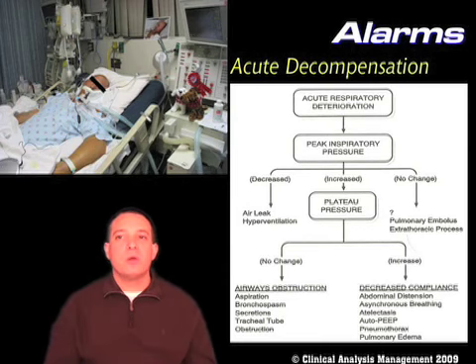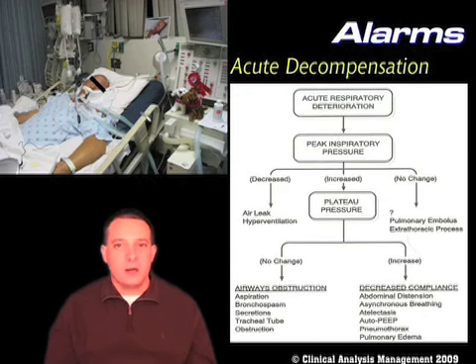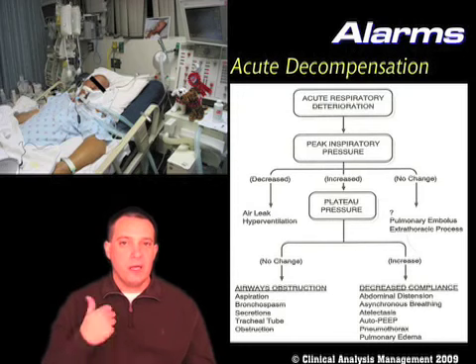If the peak inspiratory pressure is lower, then that tells us there's potentially an air leak, i.e. the ventilator circuit has been disconnected, or the patient's ET tube cuff has been compromised, or it tells us that the patient is overbreathing the ventilator and our ventilator settings are not meeting the patient's need. Therefore, we need to do something with our ventilator settings.